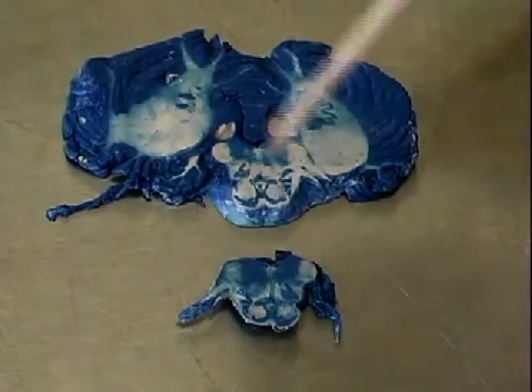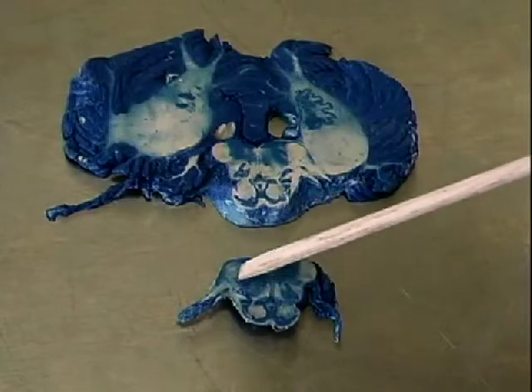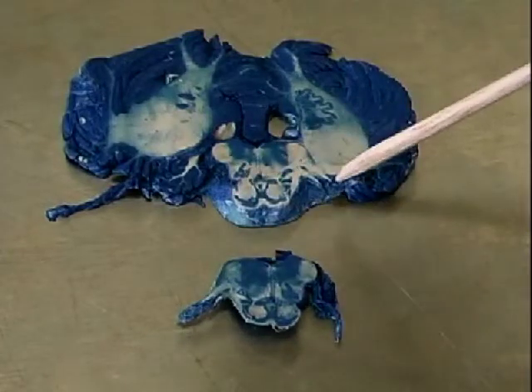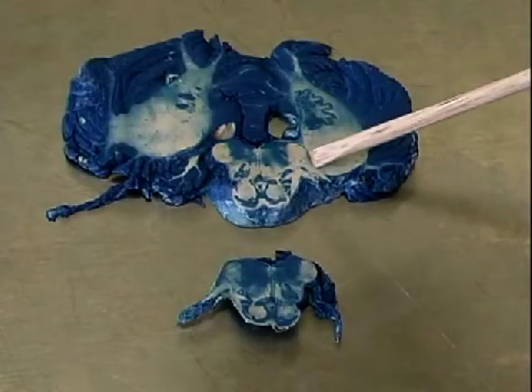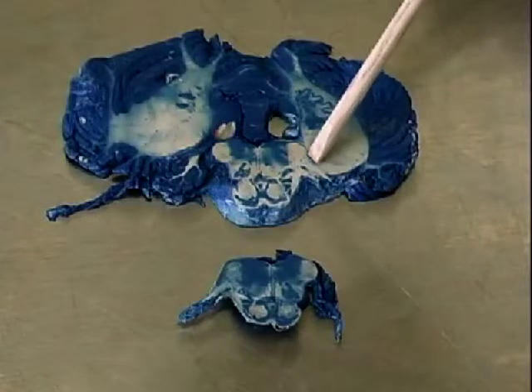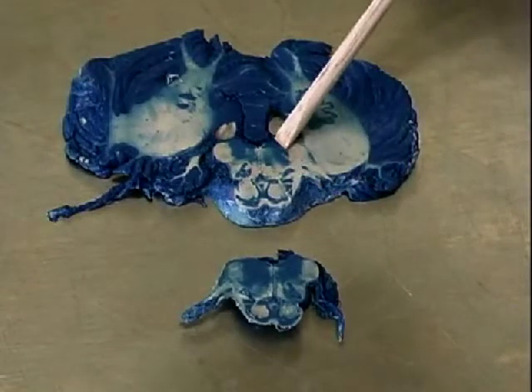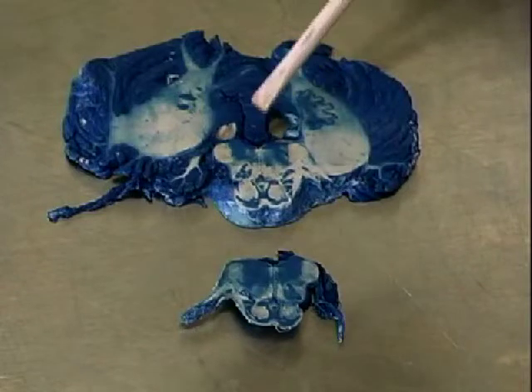Okay, coming in. And the vestibular fibers come in a little more ventral and go underneath the inferior cerebellar peduncle and go in this area right here, the vestibular nuclei. So you can see on this case, here's the vestibular part of the 8th nerve, the ventral one, the dorsal part of the 8th nerve. The dorsal part is going to go into, here's the dorsal cochlear nucleus right here, or perhaps part of the ventral. The vestibular part goes in here, medial to the inferior cerebellar peduncle, goes into the vestibular nuclei right here.